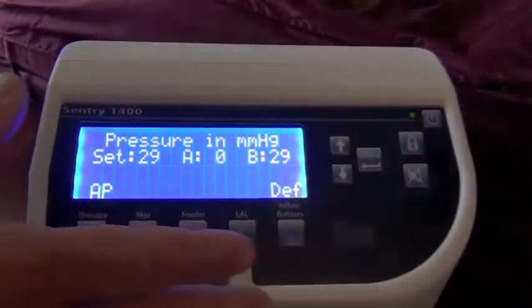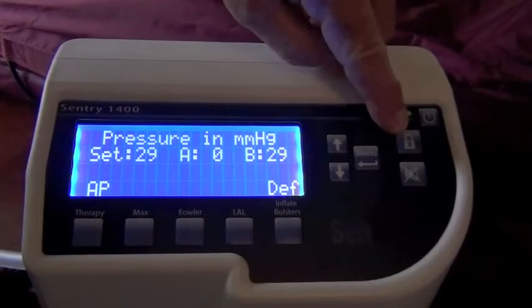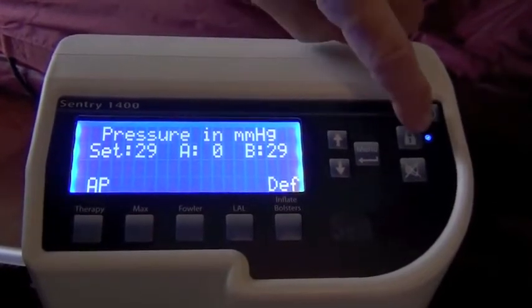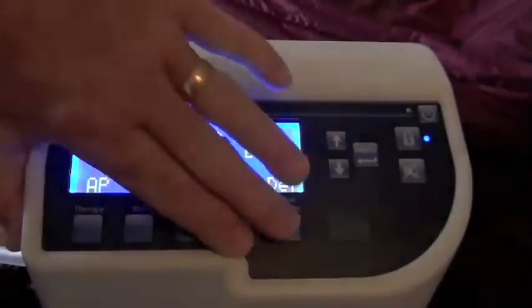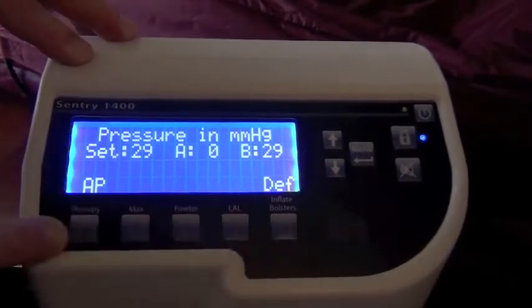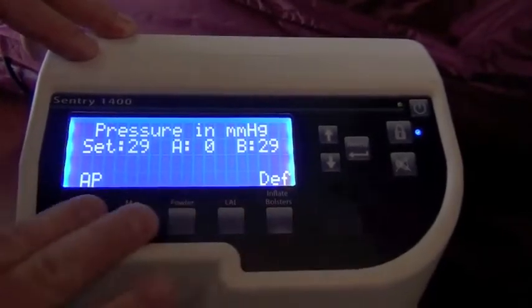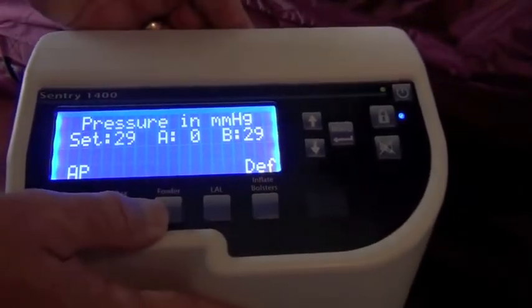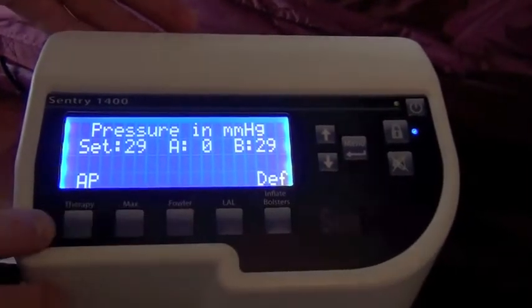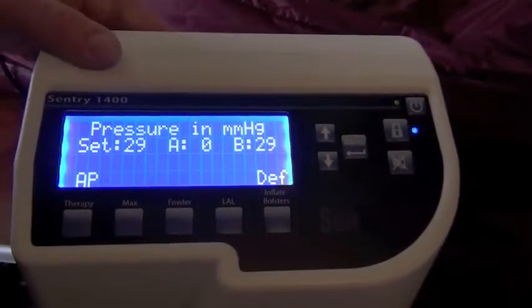Finally, on the control panel, you have two buttons over here that are kind of sitting by themselves. One is a lock symbol, which if you press and hold for a few seconds, a little light comes on, and now all your controls here are locked out. That can be helpful in situations where these might inadvertently be touched by environmental services, maybe if they were cleaning this, or if someone was moving it for some reason, or if a family member or a child or someone visiting is curious, they could alter your settings. So with that locked, your settings are safe and protected.